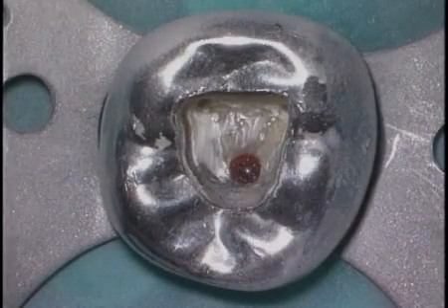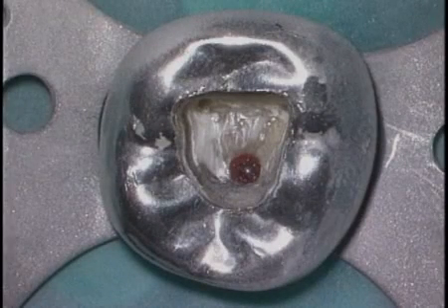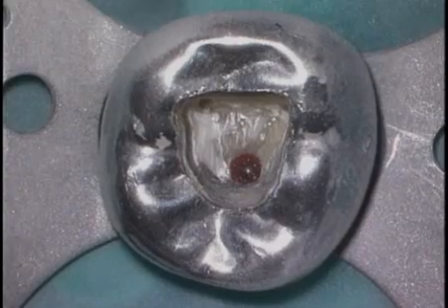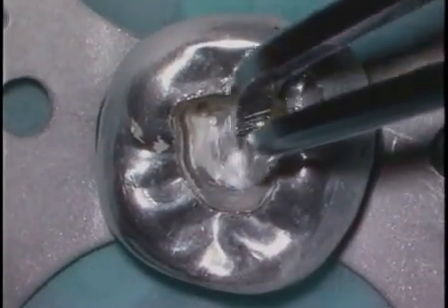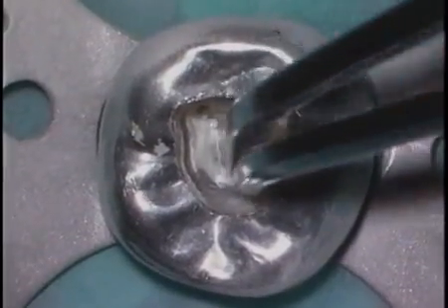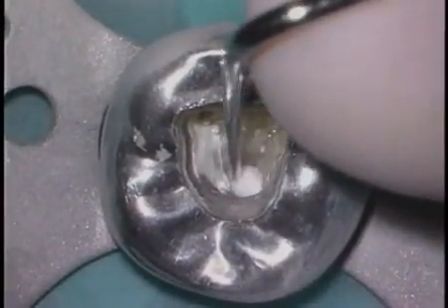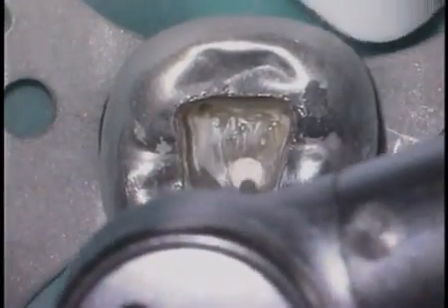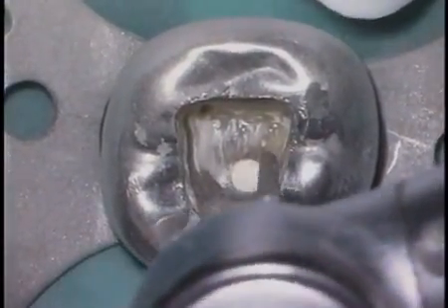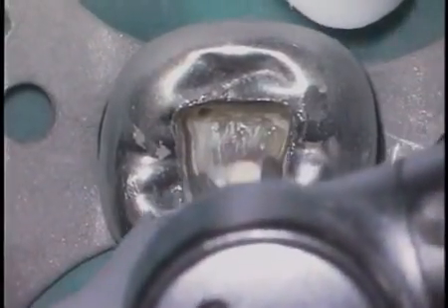This mandibular molar was previously perforated during an access attempt. Looking down into the occlusal opening, we can see the perforation site. Simulated bleeding will help clarify some of our challenges. In this case, we can use a piece of Colocoat to hold the position so the debris doesn't fall down into the bone when we expand our access cavity.